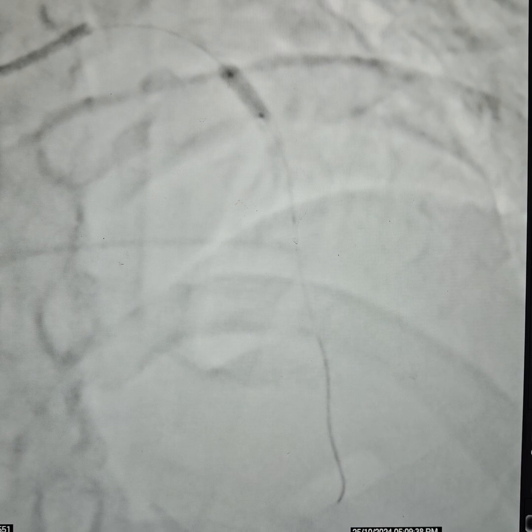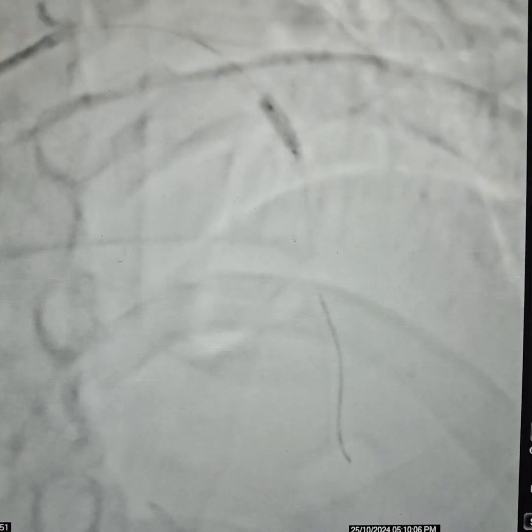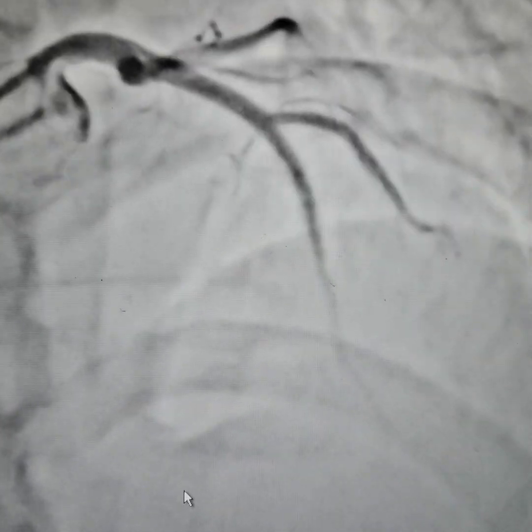We post-dilated the segment multiple times. We used the stent boost technology to clearly assess whether the stent had expanded well or not. After adequate post-dilatation, we used stent boost again and confirmed good expansion.